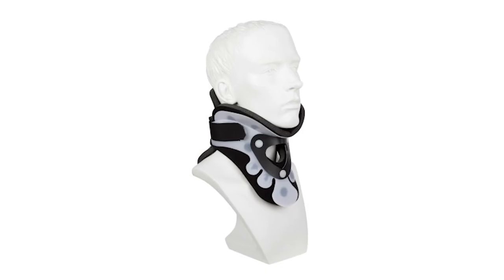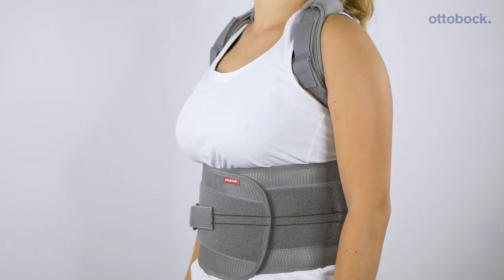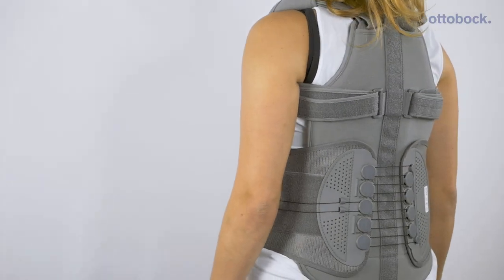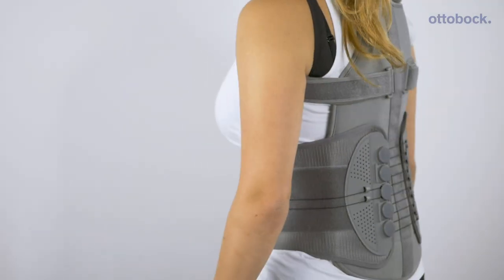The Smart Spine range from Ottobock features the universal collar, height adjustable collar, the LSO in short standard and high, the SI belt, hyper extension brace, and the Smart Spine TLSO.